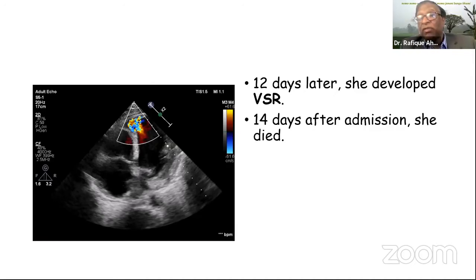Yes. But if the conduction comes back, then we can observe, but we have to be very, very careful about this group of patients. Let's look at the ideal scenario: you have revascularized, you put a stent and the conduction has come back. What I would probably do is look at the conduction system in the EP lab. If I find that the HV interval is good, and if I do rapid atrial pacing there is 1-to-1 conduction to a rate of 100, 120 beats per minute, then I can tell the patient, you'll be fine. But this was surprising, it came back. Normally they don't come back that well.